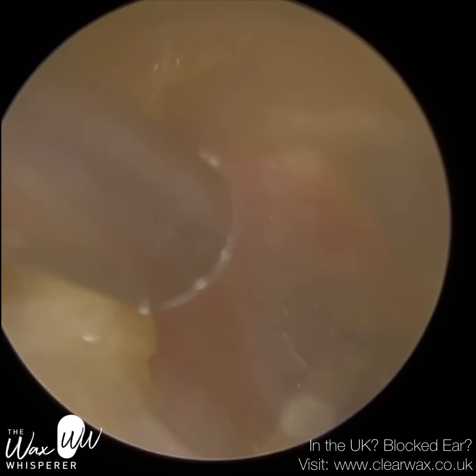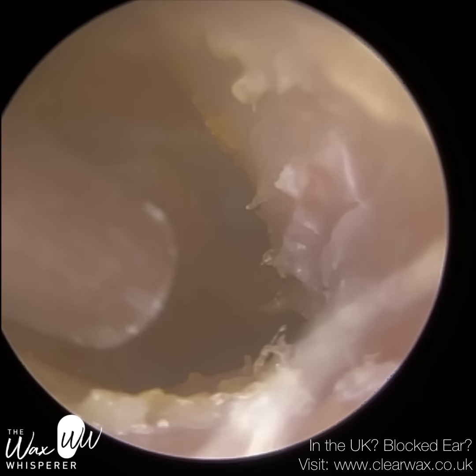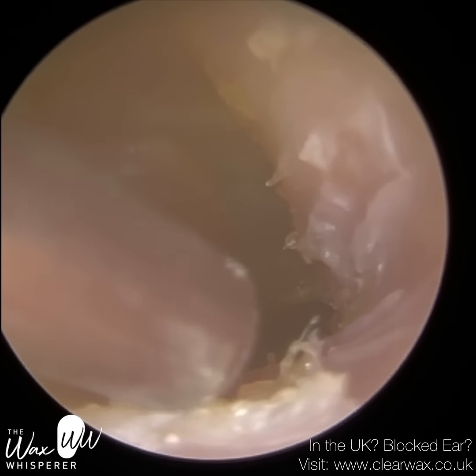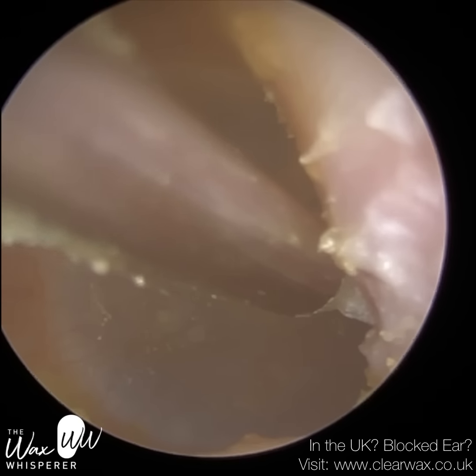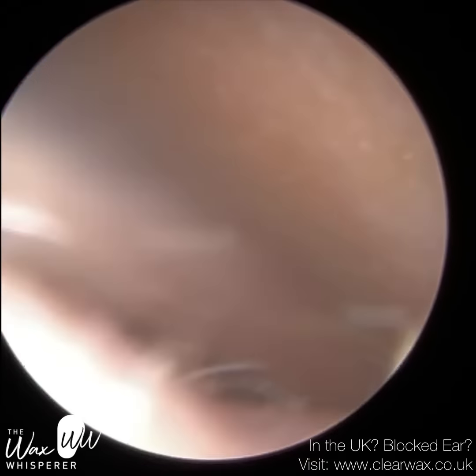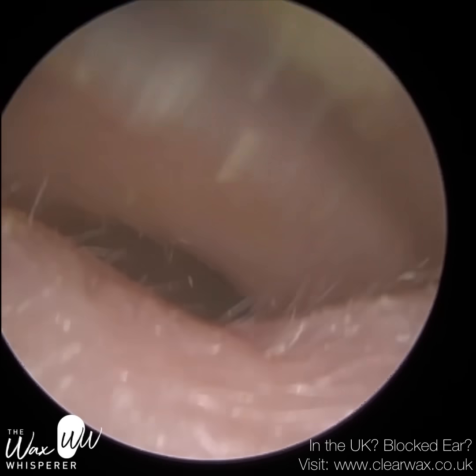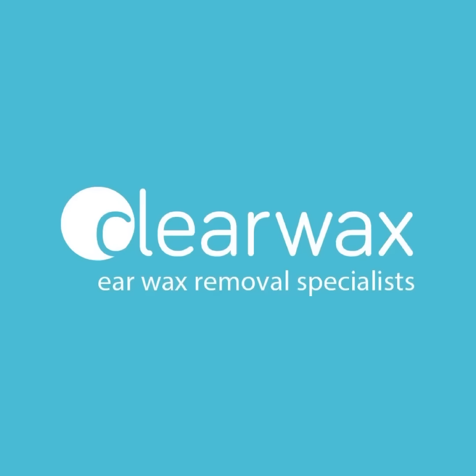An endoscope can be very difficult to teach people. For the last year or so I've decided to halt the ClioX training courses because it's becoming more apparent that delegates find the technique very difficult to acquire — it does take a lot of practice. About a year ago I developed a new device called the Waxscope. The Waxscope incorporates a speculum that you attach at the end of the device, designed to stretch and widen the ear canal, making it more user-friendly. The view isn't quite as good as the endoscope, but it's the next best thing on the market, and I'm very excited about its launch.